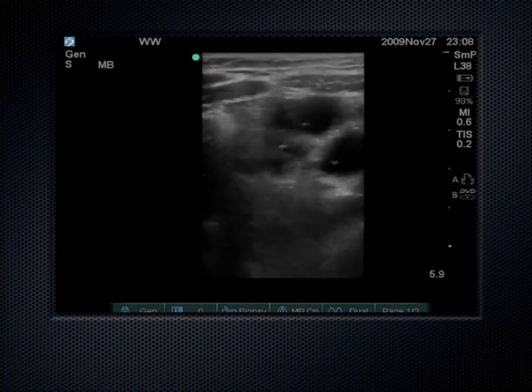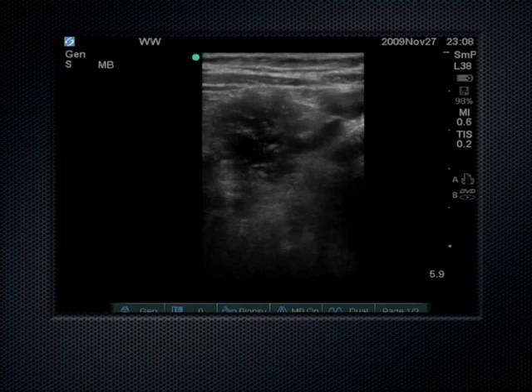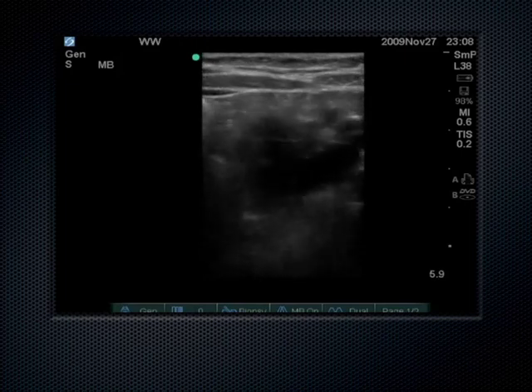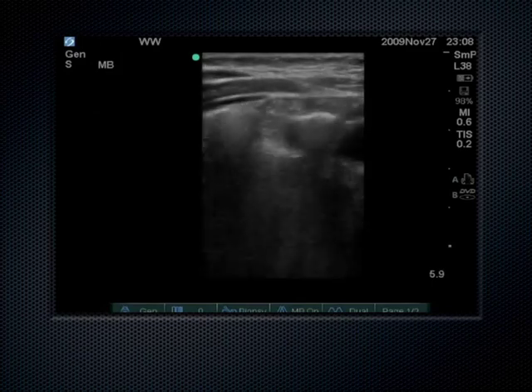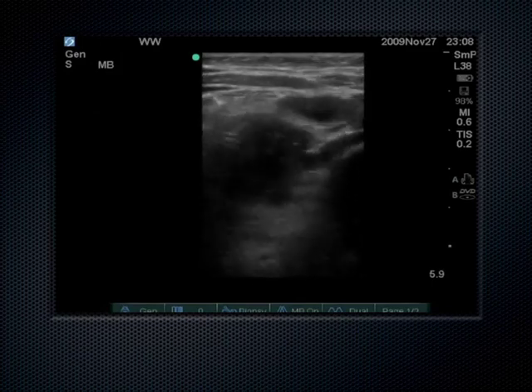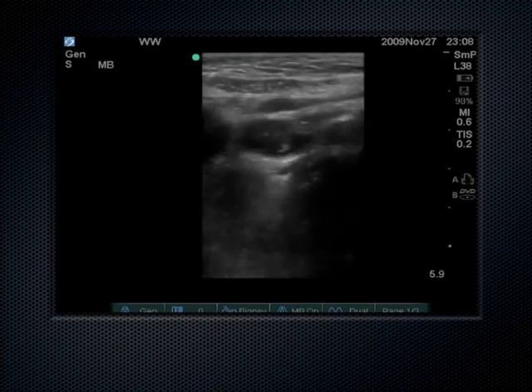Now, if you have appendicitis, all these areas down here in the peritoneal cavity get inflamed. So it's very painful to be compressing these things. This is the peritoneal lining right here. I can see that peritoneal lining very easily on ultrasound. Everything down here is all intestines, and there's psoas muscle coming all the way up and coming in contact with the abdominal wall musculature.